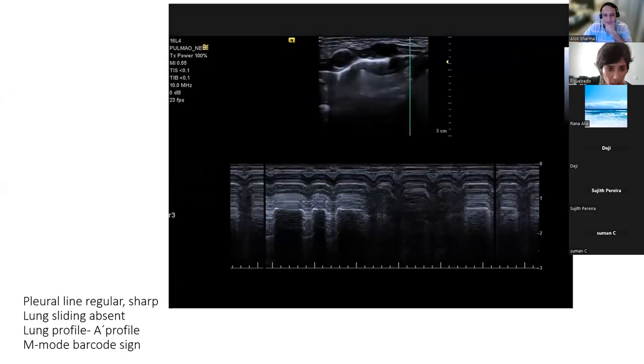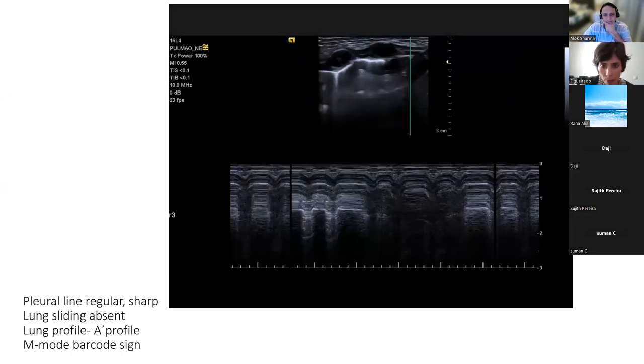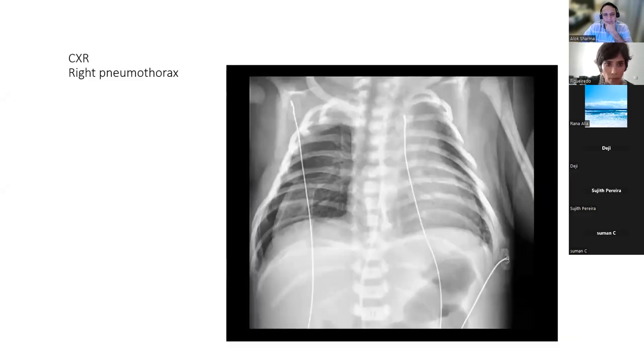Carry on. And in this, it is the same. Yeah, and this was... Is the X-ray at this time with the pneumothorax here. Yep, so you can see it. Do we have any of the initial X-rays by any chance? No, we don't. Okay. I couldn't have it.